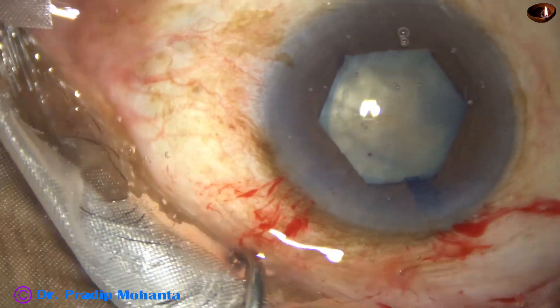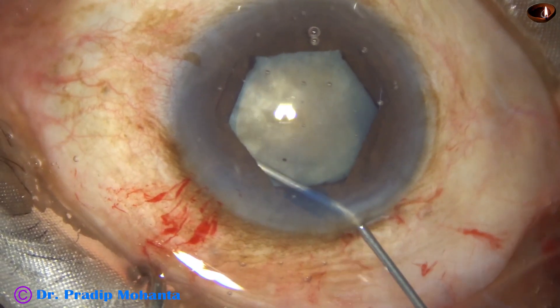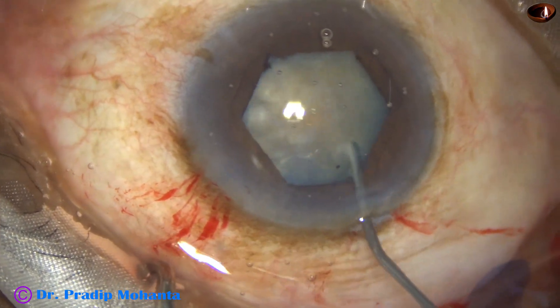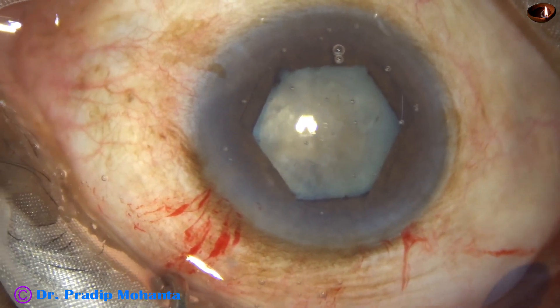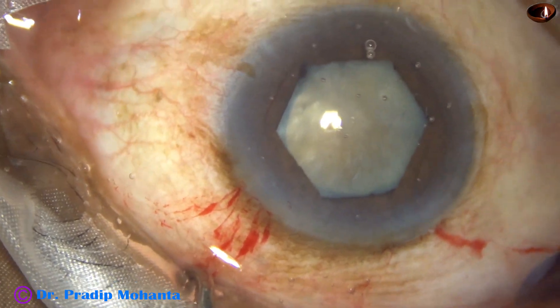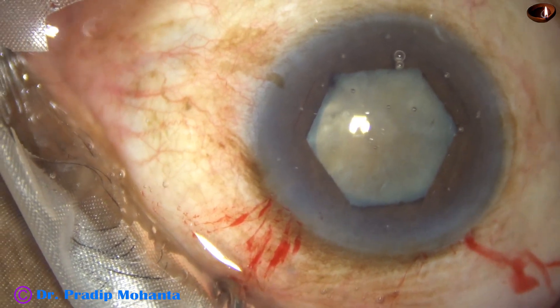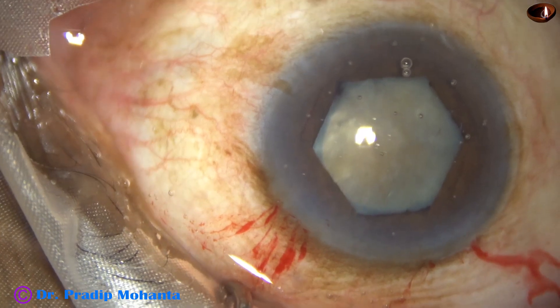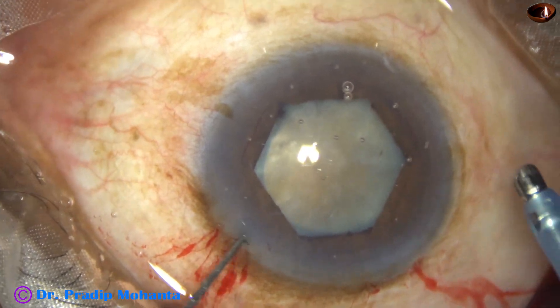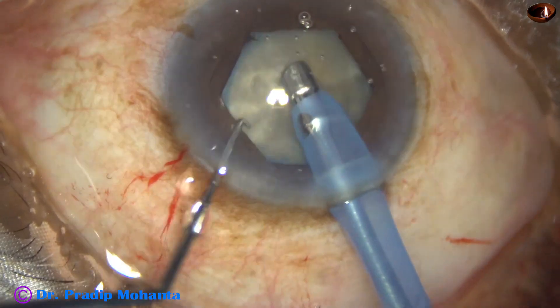Hydrodissection is done with BSS. I inject some hydroxypropylmethylcellulose and introduce the tip of the phaco needle. I go bevel down, remove some superficial lens matter, and then I apply my technique which is called submarine chop — Mahanta's submarine chop.